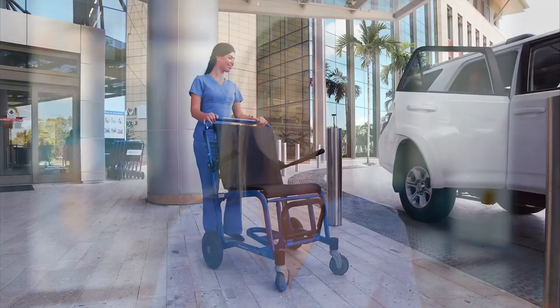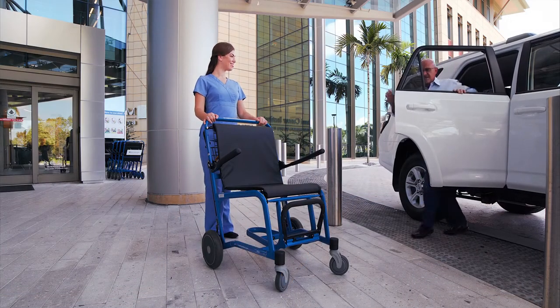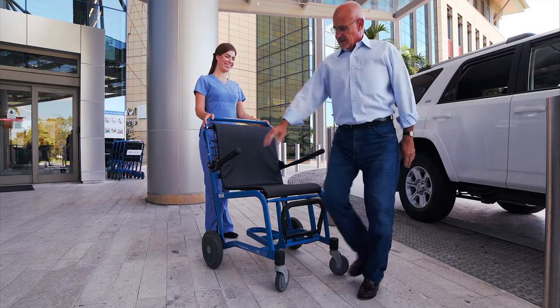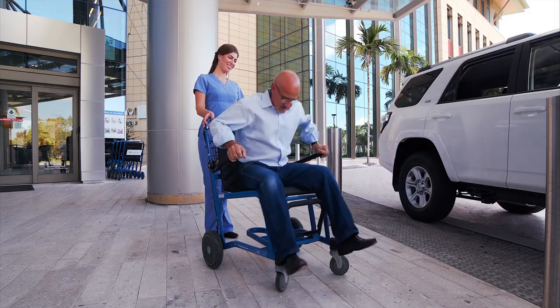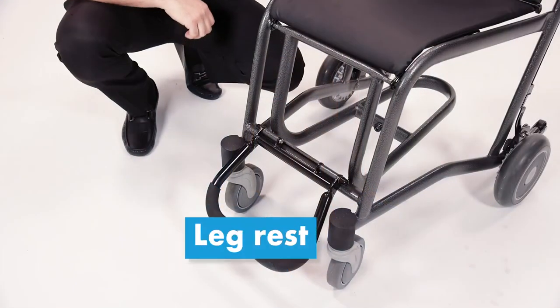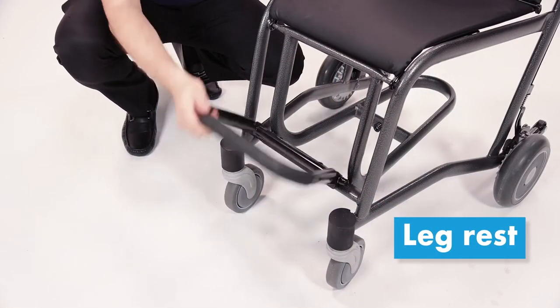Alternatively, it is also perfectly safe to enter and exit the Ranger from the front. Simply ensure that the footrest is in the up position, then seat yourself securely in the chair and lower the footrest. The footrest is made from quality steel — it is non-removable and easy to lift for comfort and safety.